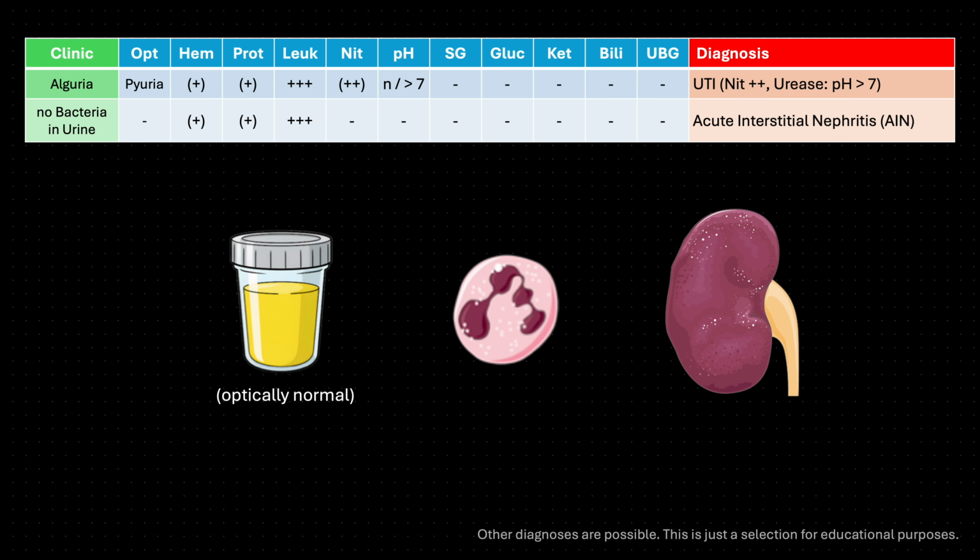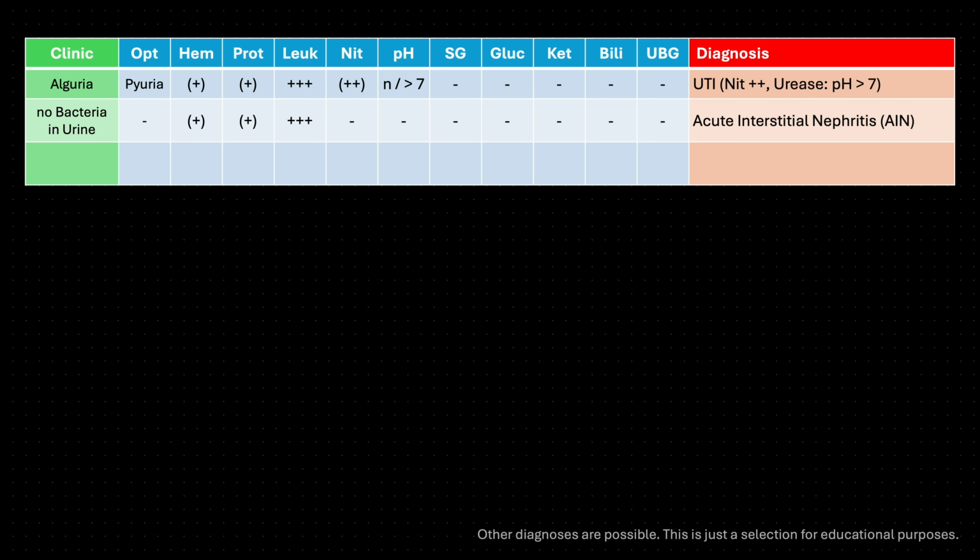Here's another example. This is a patient with little protein in the urine, and clinically he seems fine, but his creatinine is elevated and he has a lower GFR, let's say of 38 milliliters per minute. What's your guess? Do you remember what proteins are measured in the dipstick? Right, it's only albumin.